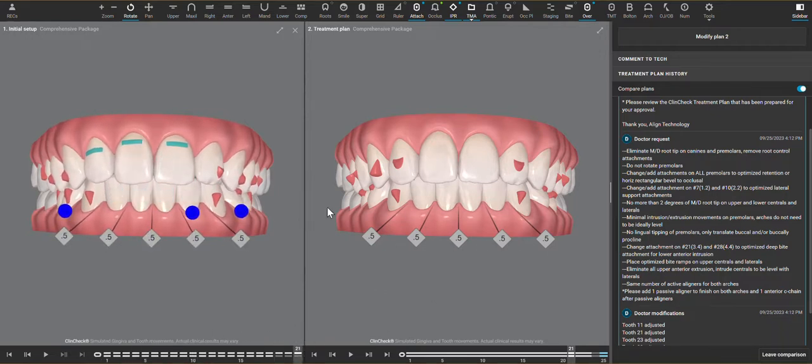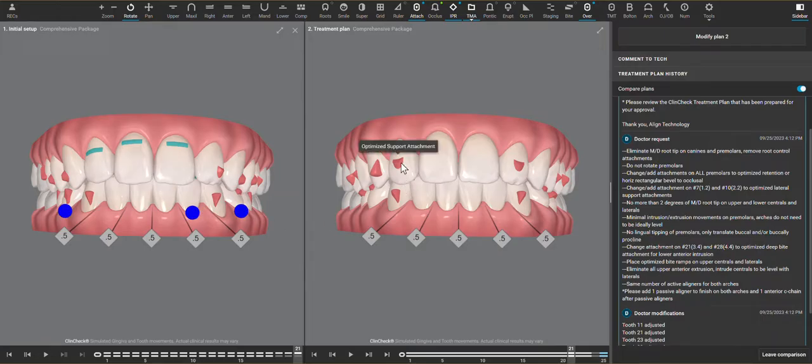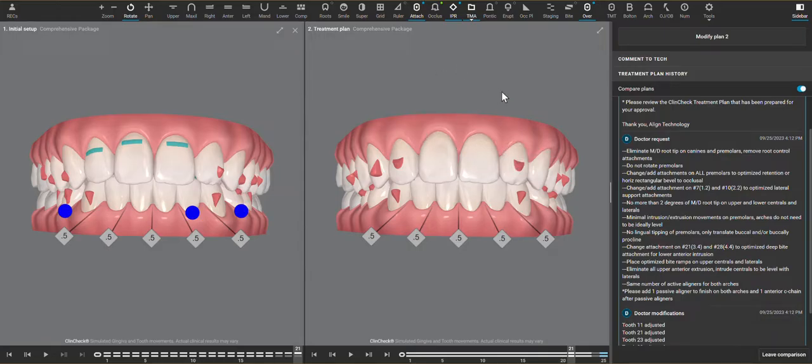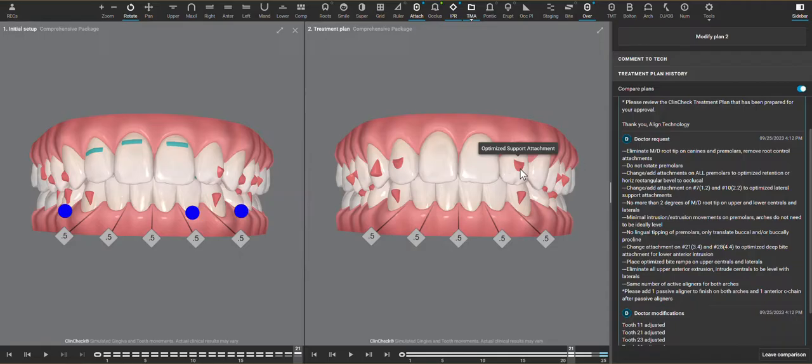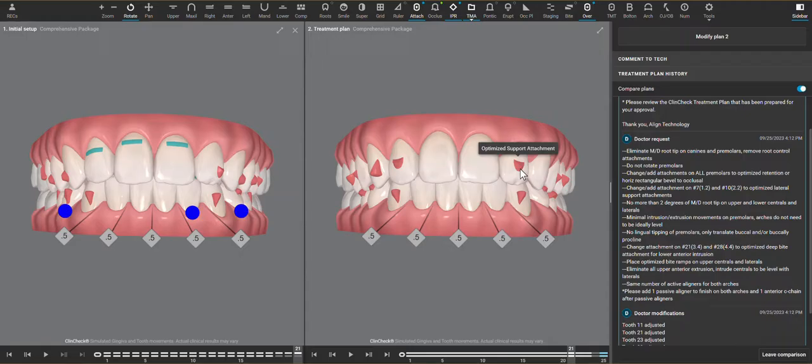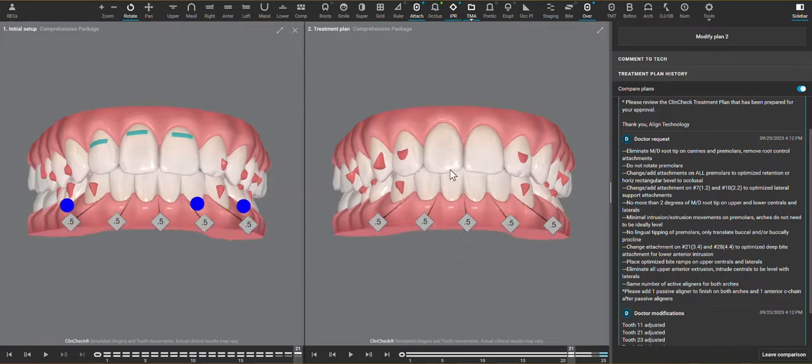Now, in order to get upper incisor intrusion, we really need to have retention attachments adjacent to the two large rooted teeth here that are intruding. And that would be the optimized lateral support attachments. Alternatives would be to put rectangular attachments on the laterals. Those visually stick out more for the patients, and I don't find that they are significantly more effective. These tend to work very, very well.